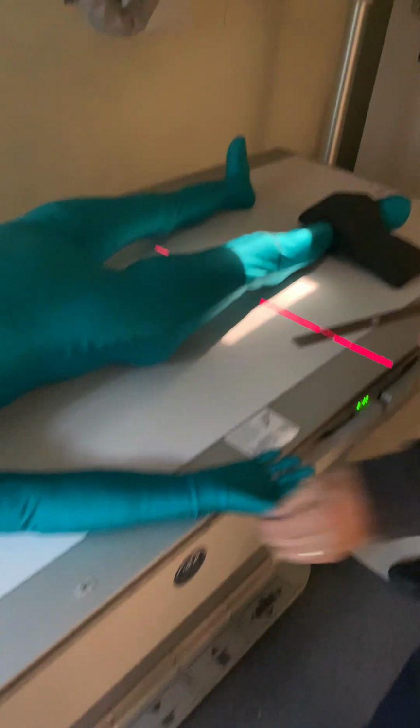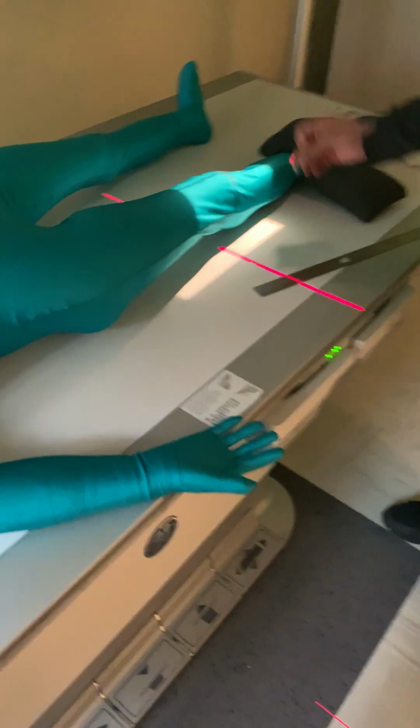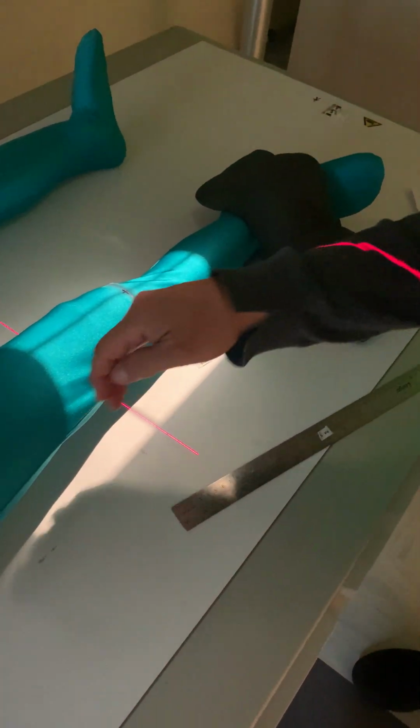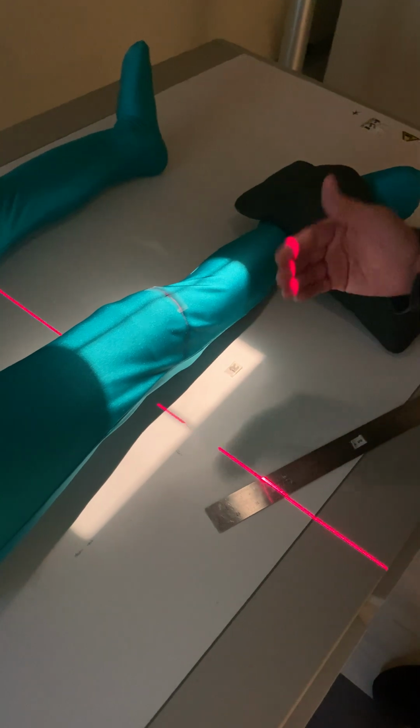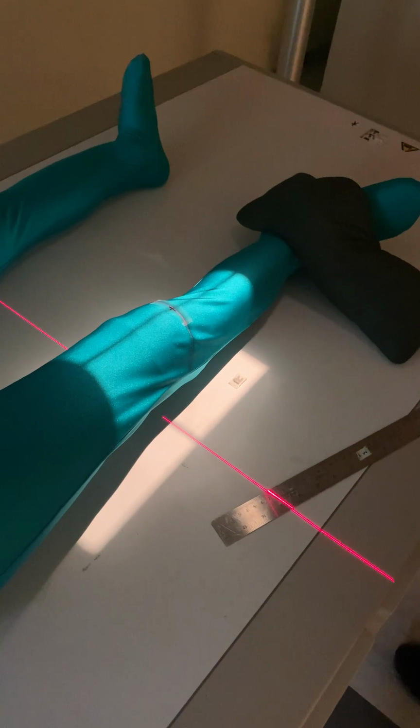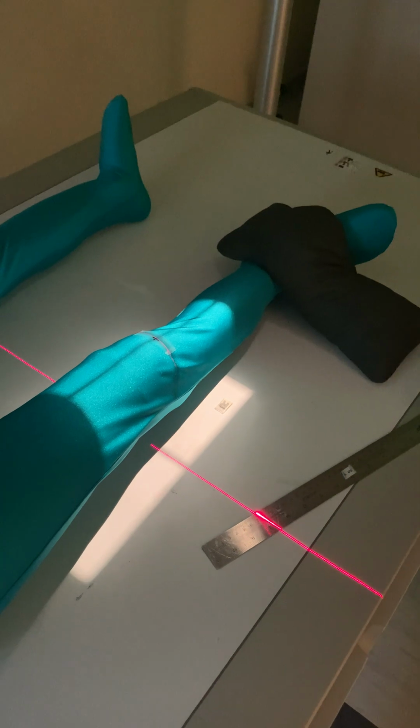Last thing, but very important as well, is to place your marker along the lateral aspect of the body part and in an area that does not cause a superimposition over the anatomy. Once I have done this, I'm ready to take my exposure.